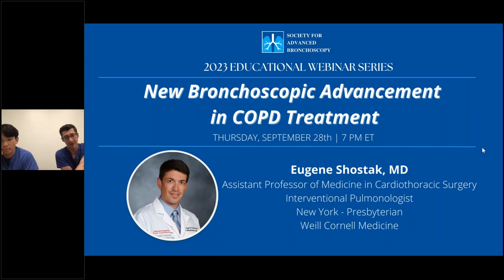I think June and I both tend to go for APC for bleeding and mucosal bleeding in the airway. I think our preset is like 26 watts and 0.8 liters per minute of argon flow. You know, there's a range there. Some people go lower, some people go higher. You probably don't need more than a liter per minute of flow for APC.